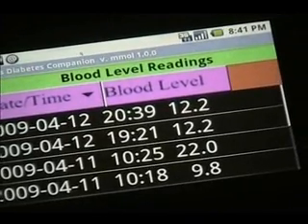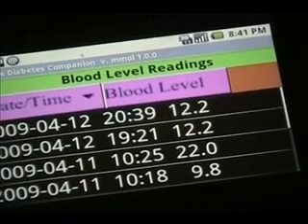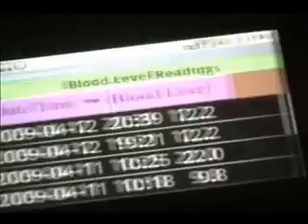Okay, that's about it. We are truly international in the fact that we're supplying readings that they would use. And that's about it. I'm going to be signing off.